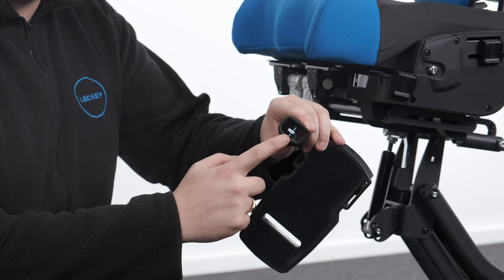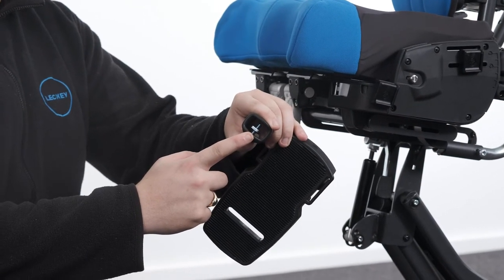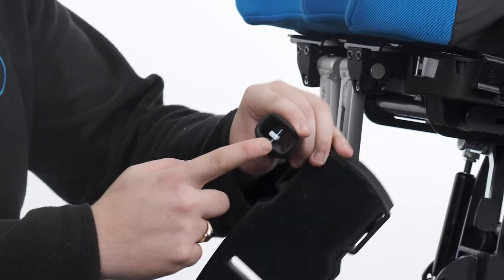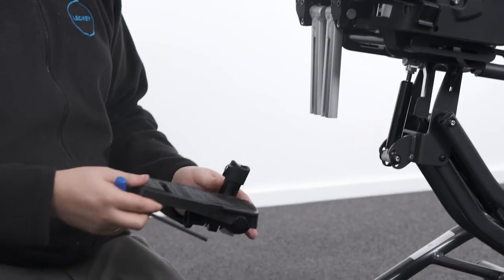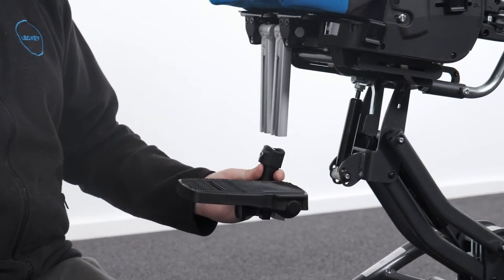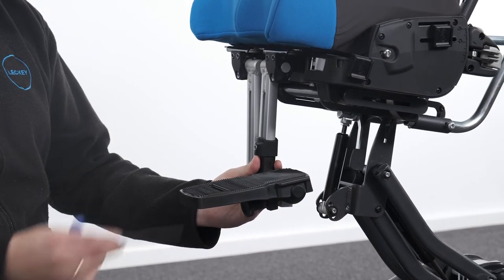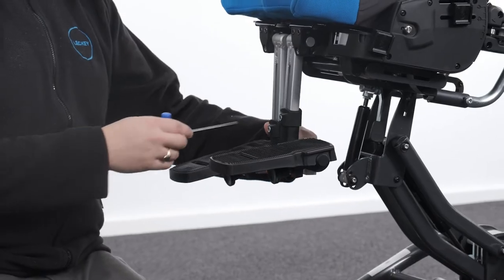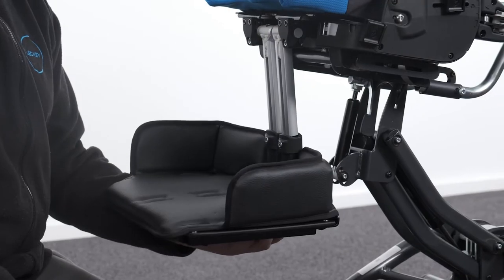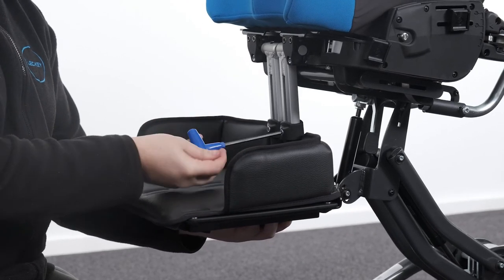Attaching the footrest. To attach the footrest, orientate the locking plate within the lower leg stem so that the short edge faces upwards. Slot the lower leg stem over the end of the upper leg stem ensuring that the locking plate is retained within the upper leg stem extrusion. Secure in place with the bolt using the Allen key. The individual footrest can be attached independently, whereas the single foot plate requires both lower leg stems to be slotted onto the upper leg stems simultaneously.